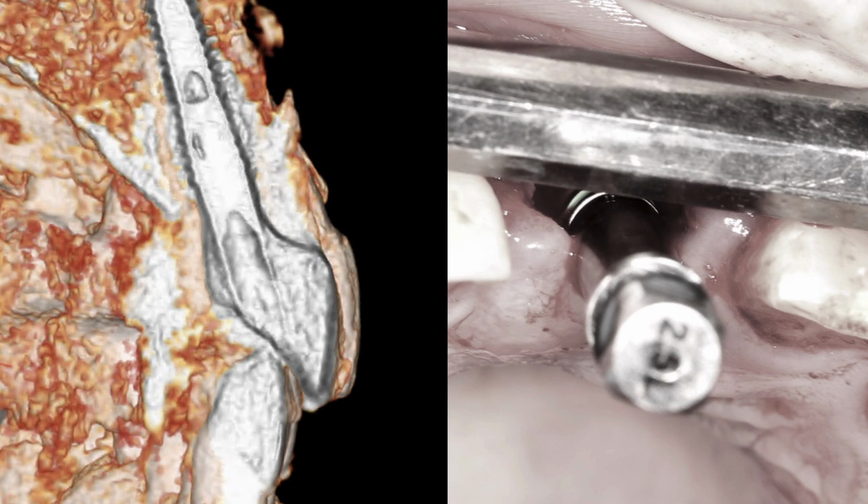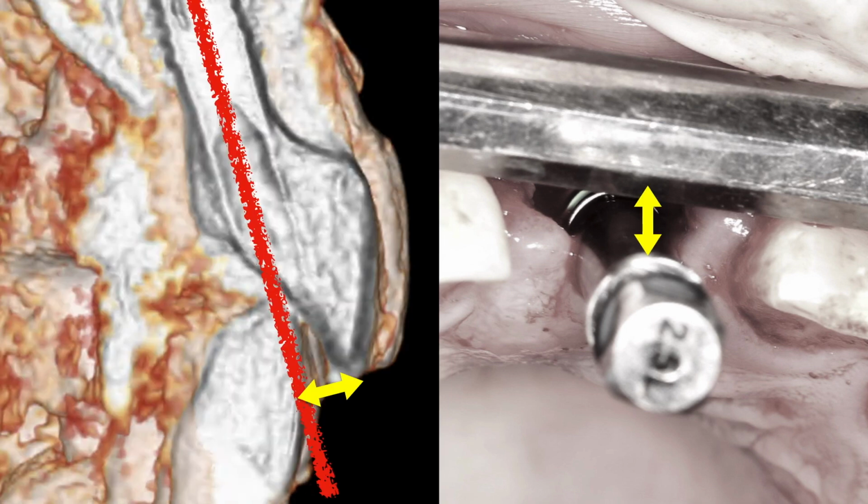So as we can see, this configuration is how we are able to get that perfect distance with the incisal edge and therefore allow the biological materials to settle in the immediate gingival facial surface, which is critical for the long-term cosmetic and biological result.